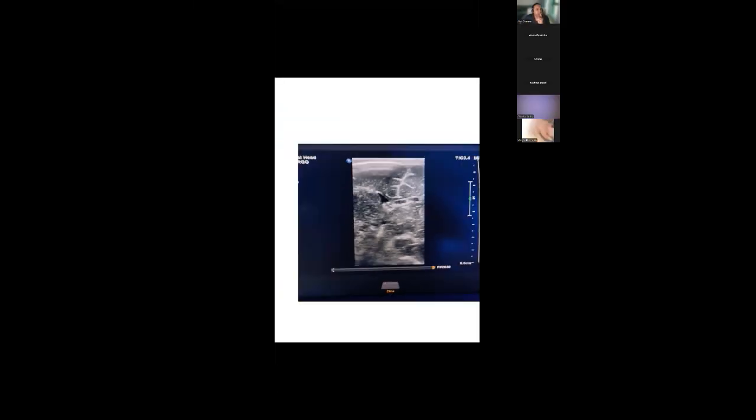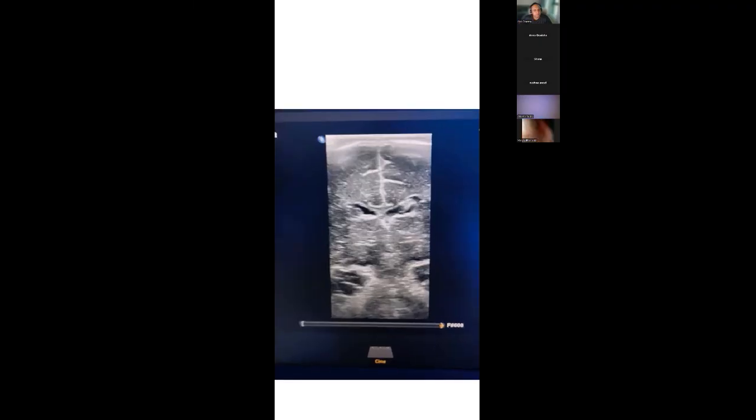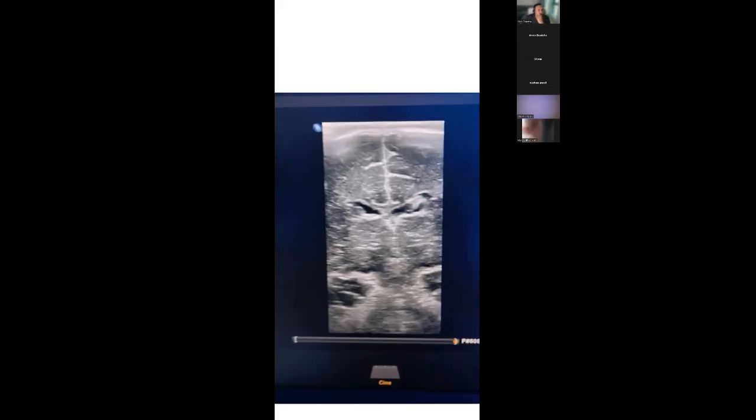But I would strongly recommend that. Are you going to follow this baby up? I just did a scan for myself, but the baby is a term baby. The antenatal scan showed nothing, so I don't know what we should do. Maybe a little bit of cystic change medially.